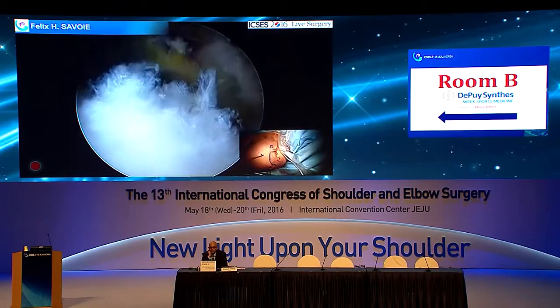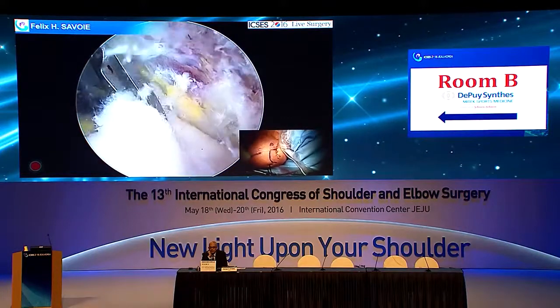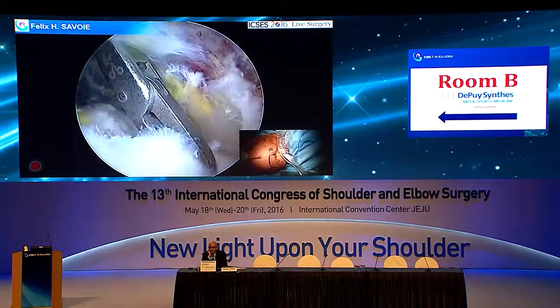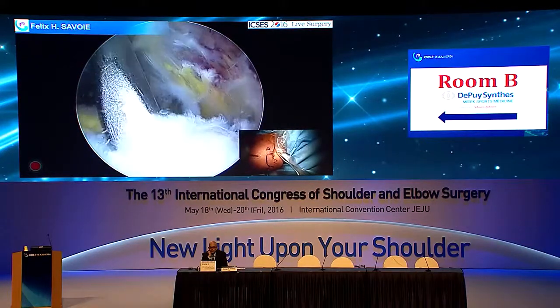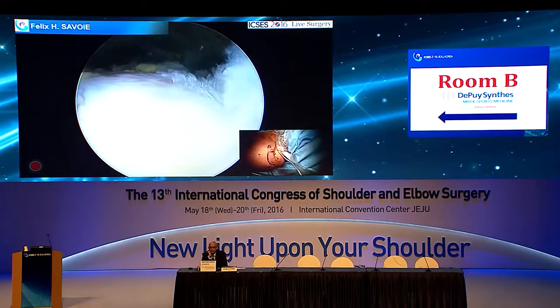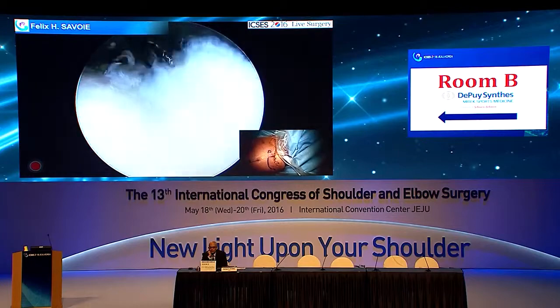And you can put a grabber in. So we really haven't done any debridement of the cuff yet, but we can put a grabber in, and you can see how really there's not a lot of tension on this. We could pull it further over if we want. We don't want to yet, and we'll show you some other things. So we can take our shaver and clean off that underside flap that you were able to see from inside, and we'll do that very quickly.